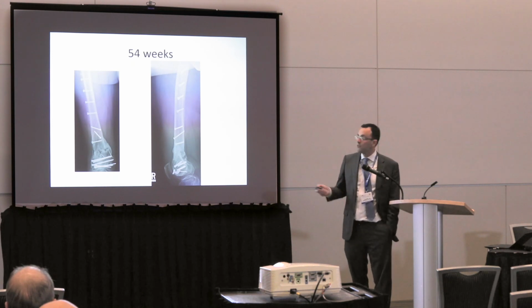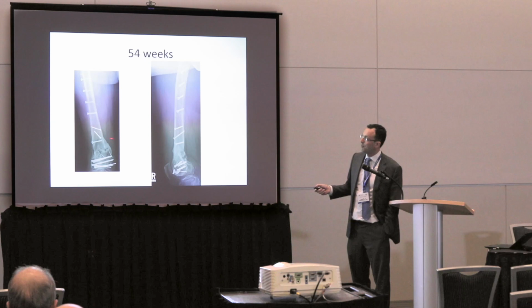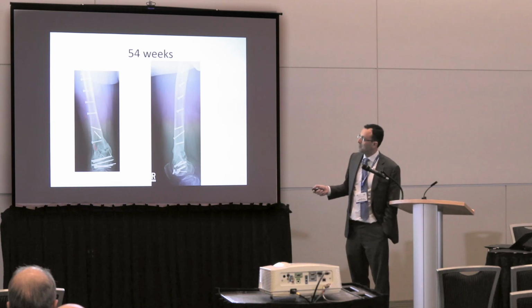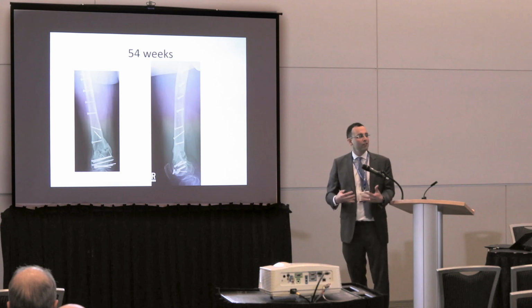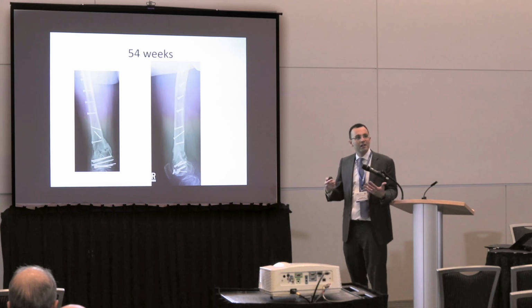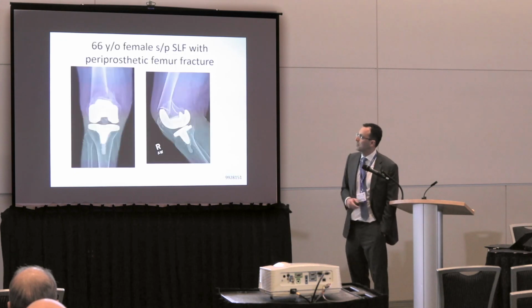And another point Bruce made is we still use the same techniques that we always use, right? You spread the screws. And I did put a few lag here, but you can now bring two. You have the flexibility in the implant, and you have the flexibility in your screw position. It really, really fine tunes what you've been taught to get healing.